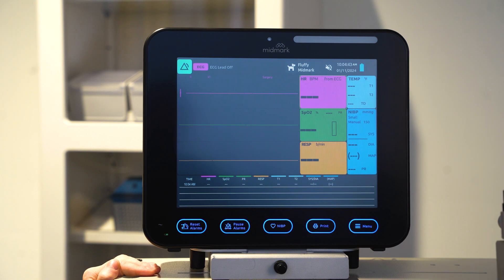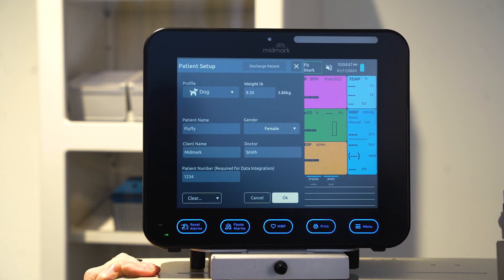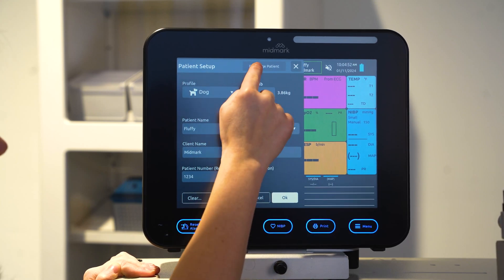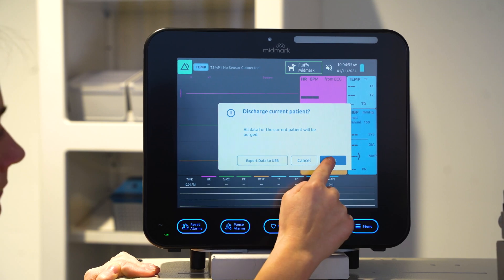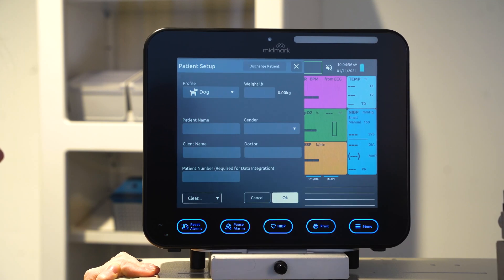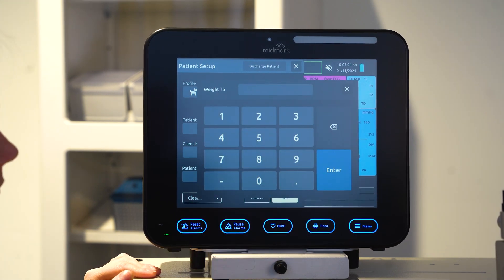Once on the main display, select the patient icon on the status bar to enter new patient data. If you need to discharge an existing patient, select discharge patient, then select yes on the pop-up box. This will clear out previous patient information before you admit a new patient. Next, enter your new patient information.